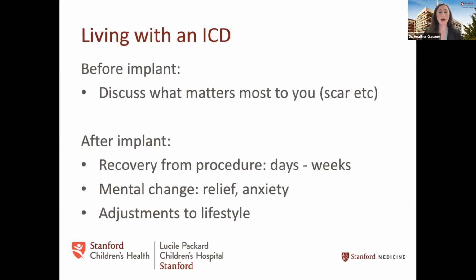So let's switch gears and talk about living with an ICD. Before you have any sort of implant, or while you're having these discussions, I really encourage you to talk openly with your physician or healthcare team and say what matters to you. And nothing is too small. I have one patient who absolutely loved going to the beach, wearing crop tops, and it was very important to her to have as small a scar as possible. So we were able to adjust the location of her subcutaneous ICD just slightly, and of course within reason, to make it a little bit higher and a little bit less noticeable for her.